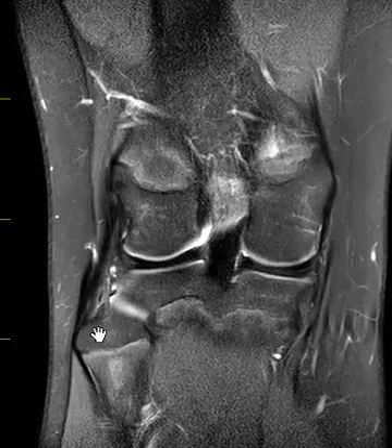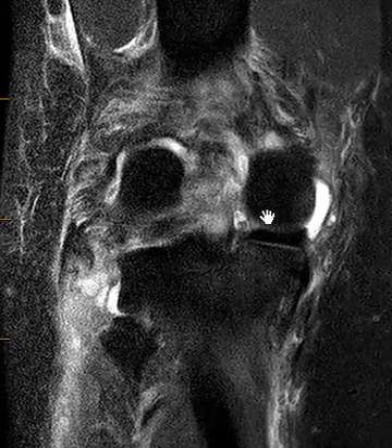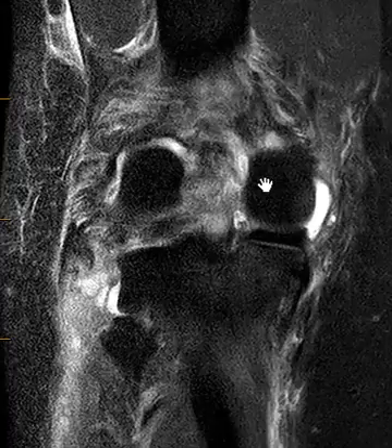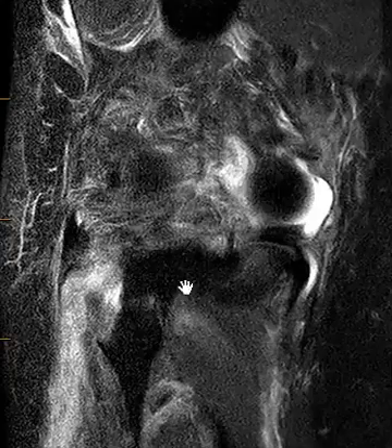Now we're going to look at another case and we'll look at the same area. This is a 27-year-old male who recently injured their knee about 10 days ago, and this patient has a problem over here where the fibular collateral ligament attaches.